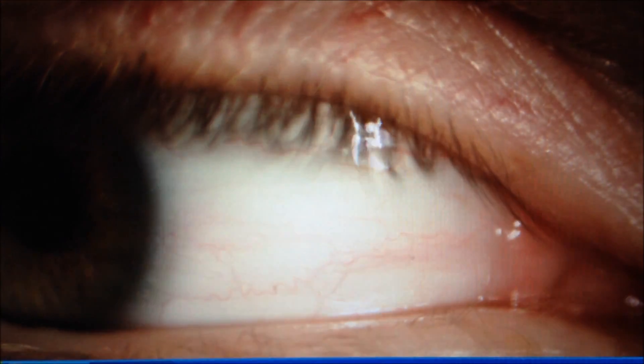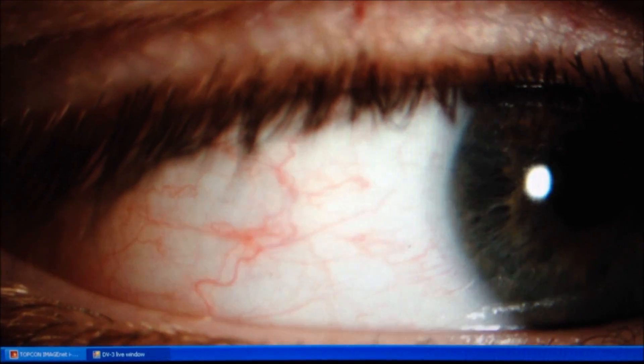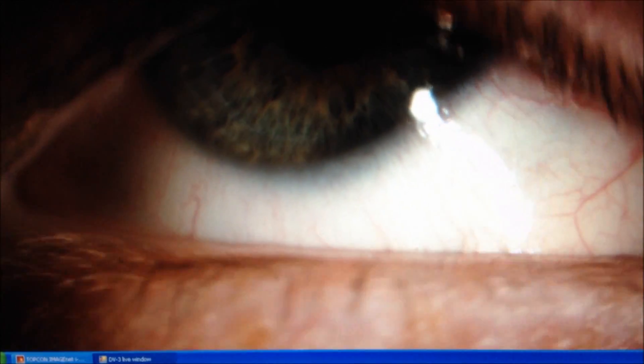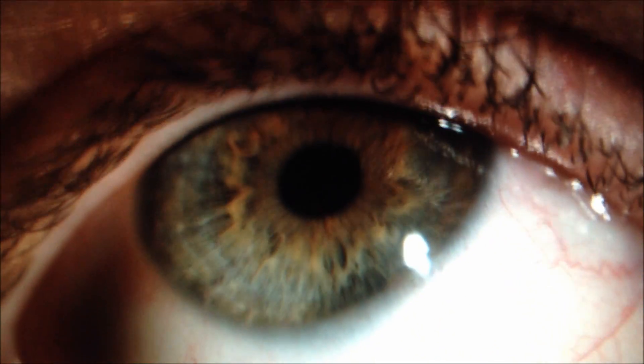I'll get you just to put your chin on the rest for sure. Now if you look left for me, Sean — get the patient to look left. We'll just inspect the conjunctiva on this side. Then we'll get the patient to look up. We'll just lower the lid down — and that'll give us a better look at just the inferior conjunctiva. You can also check the limbal redness and the limbal vascularization at the inferior cornea there.